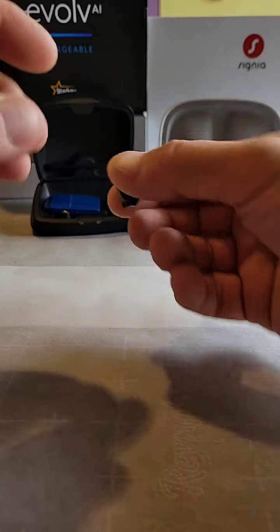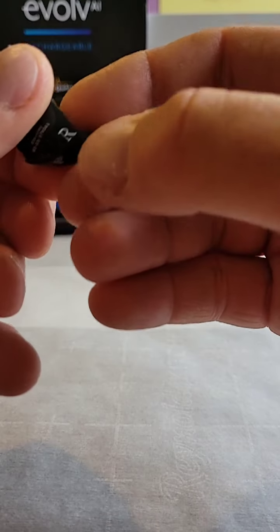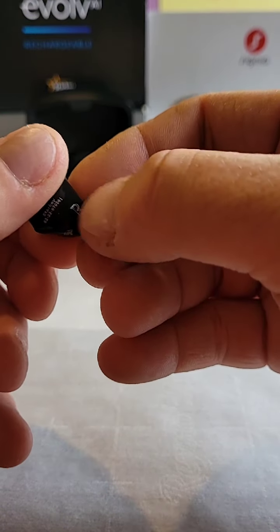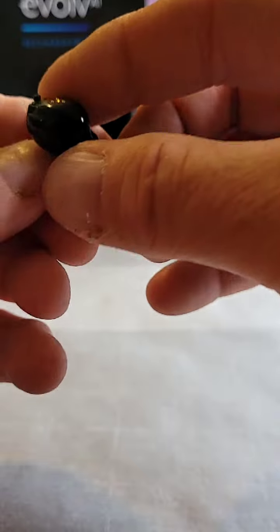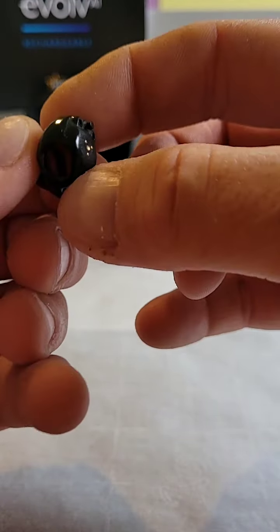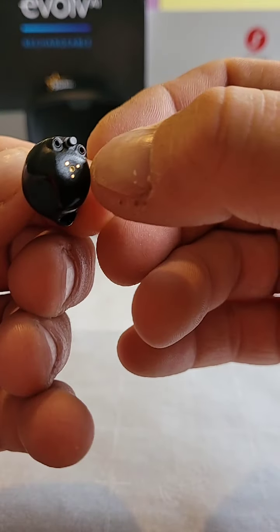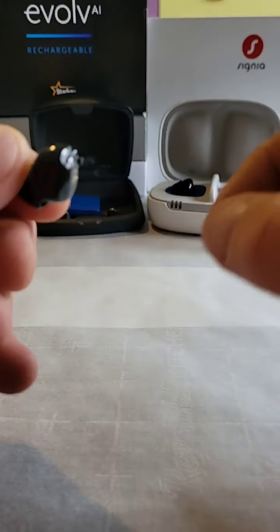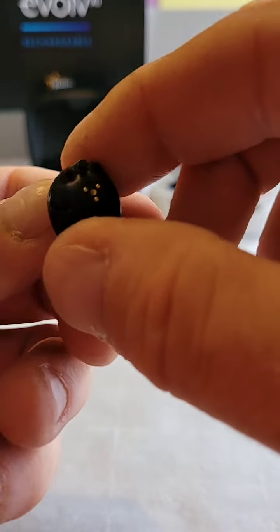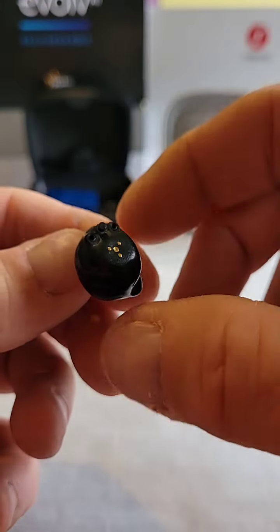With the Evolvs, they're a little bit smaller. There's an R, so I know that's my right side. Again, that will wear off over a period of time. Dexterity-wise, they're a little bit harder to maneuver and handle in your hand. Now, in my previous video, I said that it was either a manufacturing defect or they forgot, but there is a little, I call it an antenna, a clear piece of plastic that sticks straight out that you can grasp onto, and it helps you pull it out of your ear canal. Mine doesn't have that, so I will talk to the audiologist this afternoon about that.